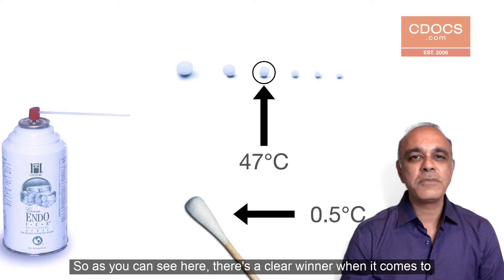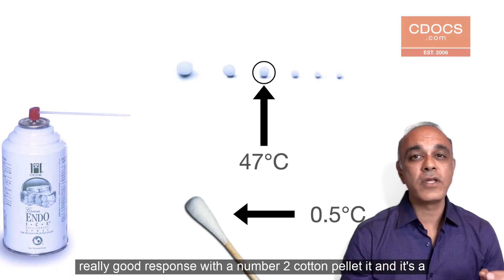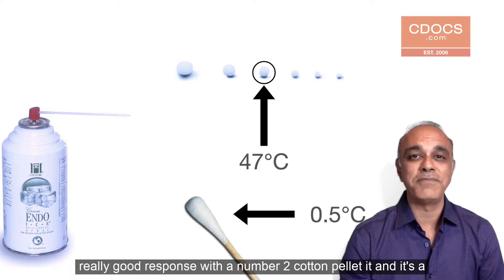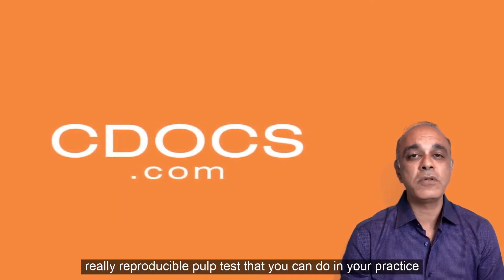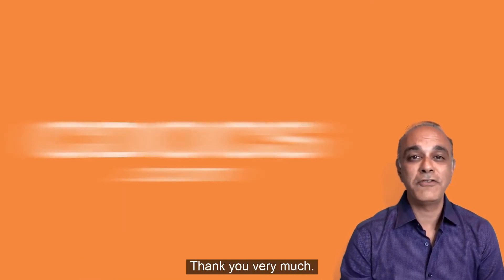So as you can see, there's a clear winner when it comes to delivering refrigerant to a tooth. I always put it on the cervical edge and get a really good response with a number two cotton pellet. It's a really reproducible pulp test that you can do in your practice starting tomorrow. Thank you very much.